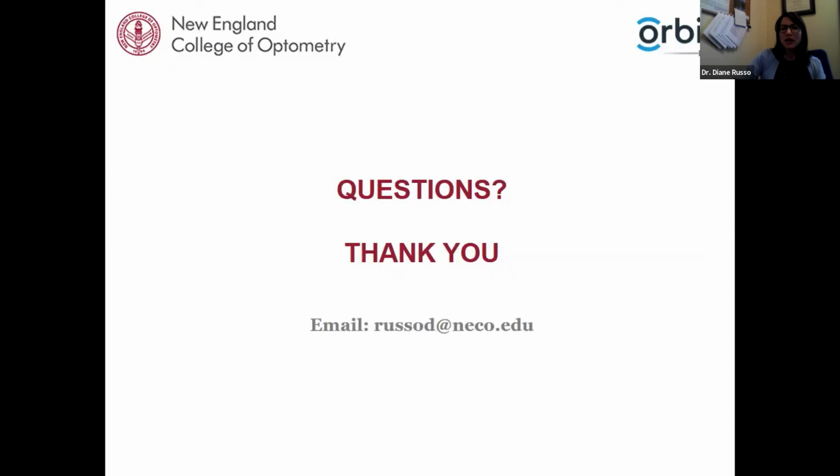I believe it's Mohindra retinoscopy. That's the procedure that I'm talking about. So even if you were to look that up, Mohindra, M-O-H-I-N-D-R-A, that is the procedure where you can reduce your test distance, do the procedure in the dark, and have the child look directly at the light. But because you're making those modifications to the test distance, you then would have to modify how you change the retinoscopy findings from the gross versus the net findings.